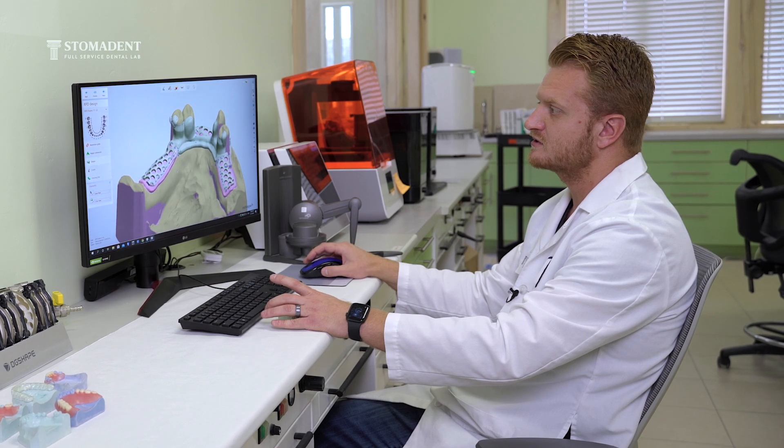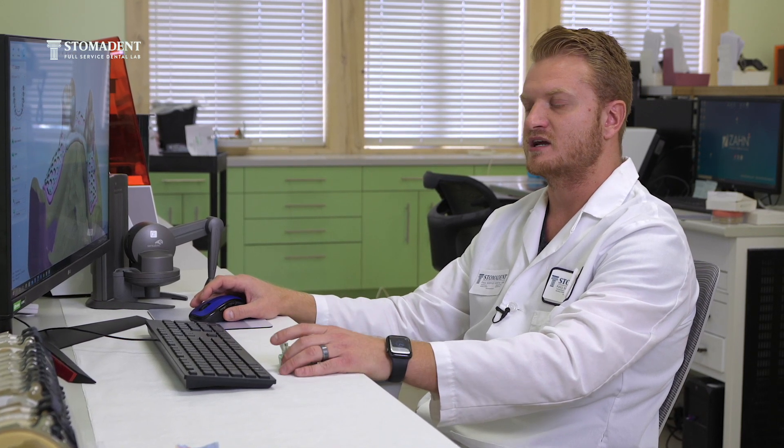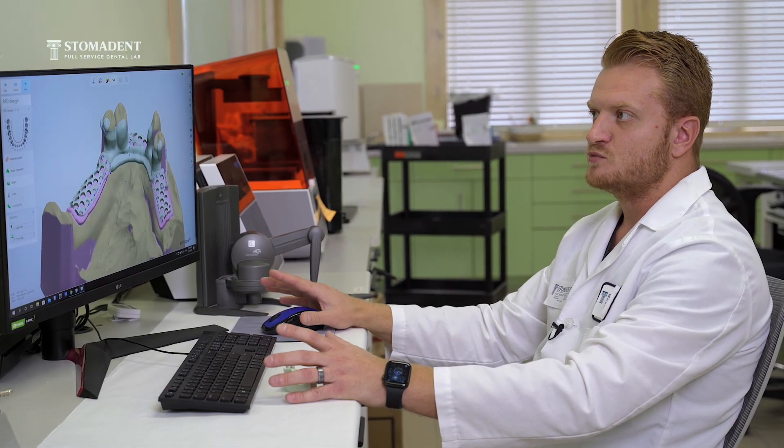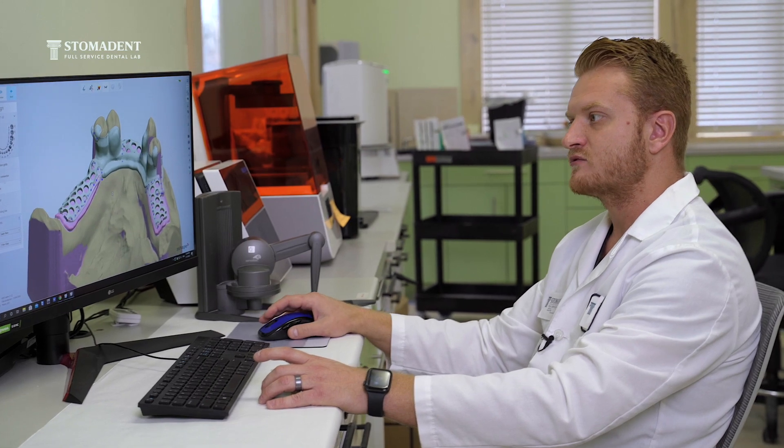The great thing about digital design is that most of the work is basically done for you if you draw your design accurately. As you're finishing the partial, you just need to bump out areas such as the connections, the elbows of the clasps, or the connection between the mesh and the major connector, while everything else gets smoothed out automatically by the software, which is Three Shape.